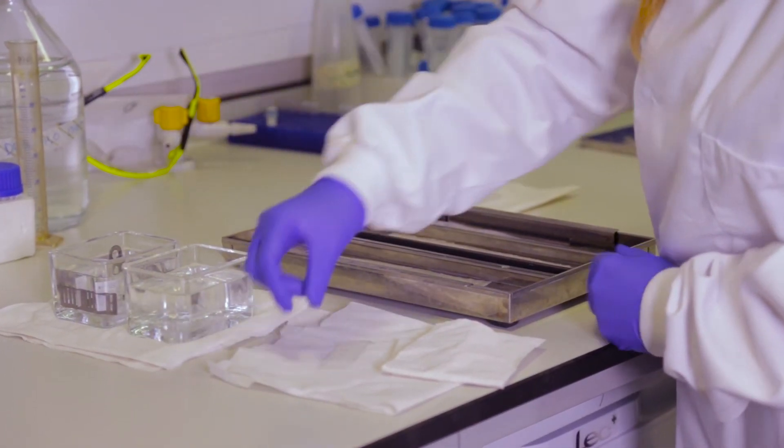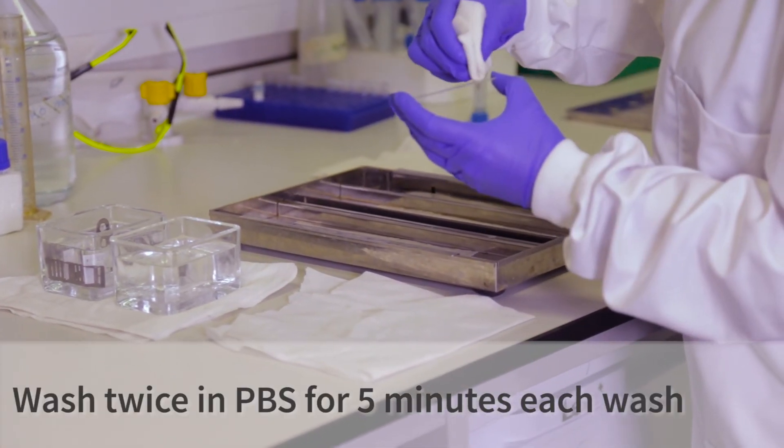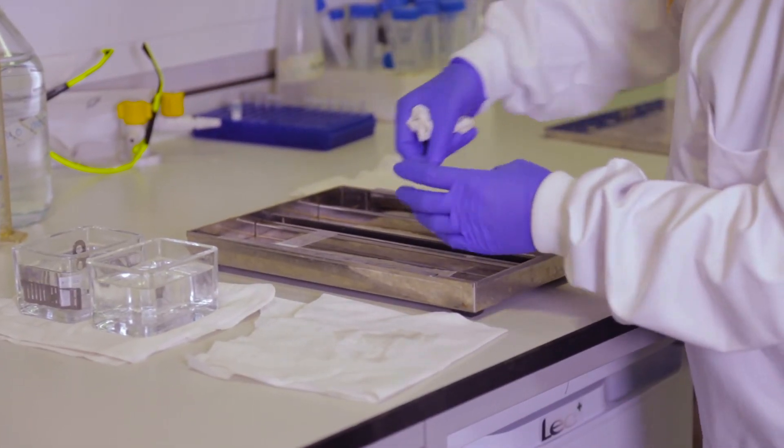After the secondary antibody incubation, the slides are again washed in PBS. You then dry the back and sides of the slides as done previously and place them back in the immunostaining tray.